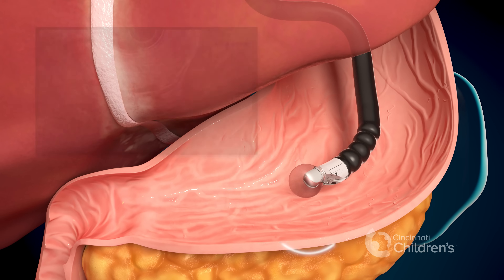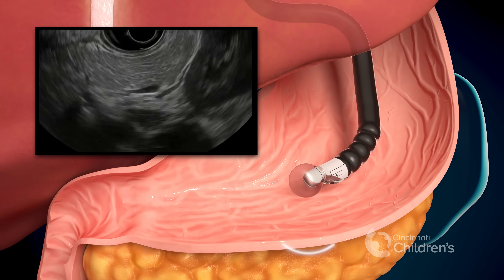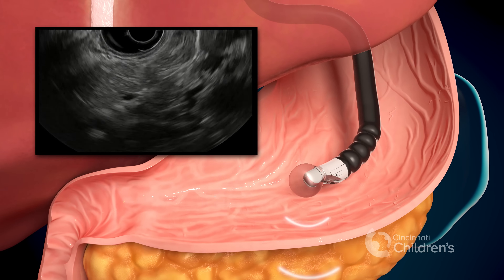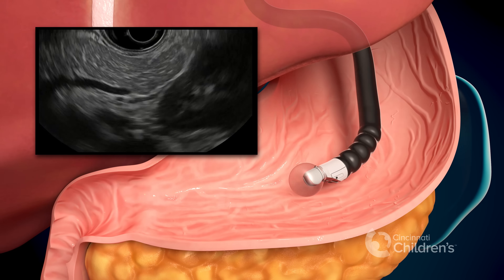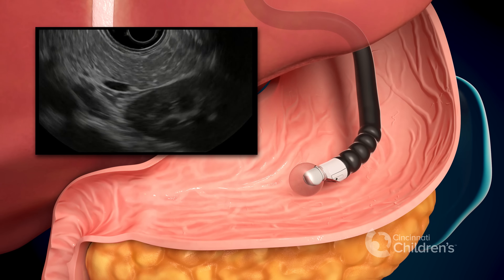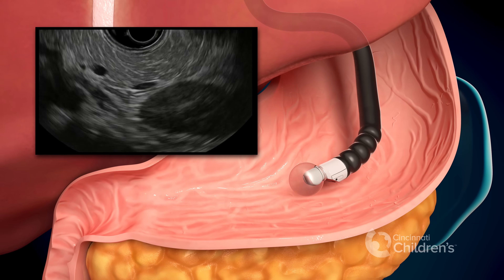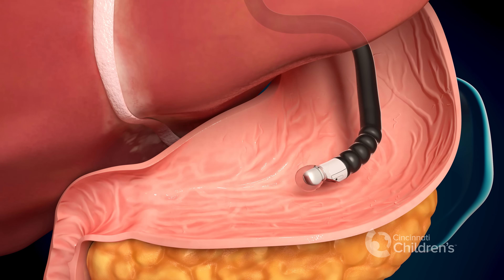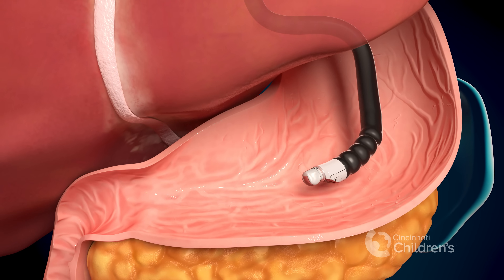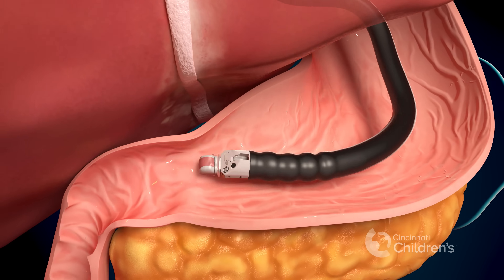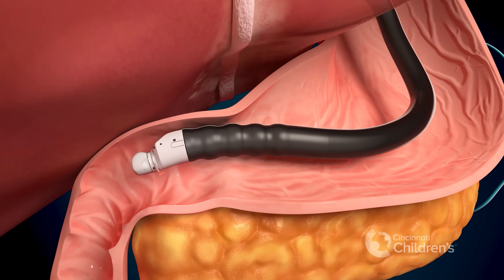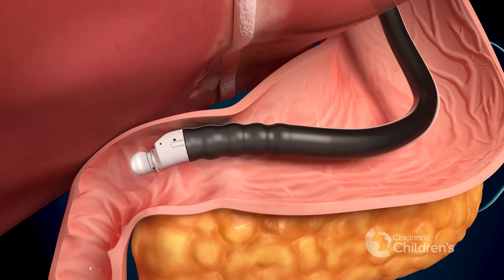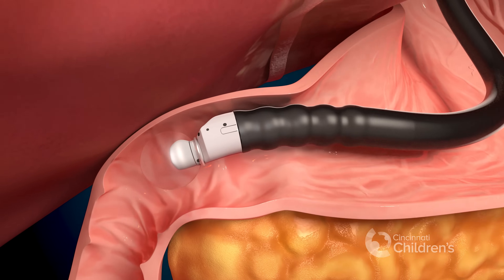Here we see ultrasound images of the pancreas. Use of the echo endoscope allows for visualization of the pancreas within close approximation of the stomach wall, particularly the tissue and ductal structures. In addition, EUS procedures can obtain tissue from organs or abnormal tissue adjacent to the stomach or small intestine to assist in making a diagnosis.